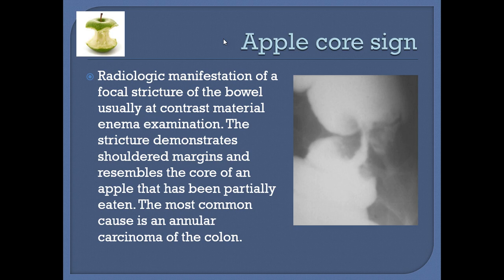Usually in obstruction we prefer to give gastrografin because barium is a thicker compound, and if there is some obstruction, the water is absorbed because the bowel transit time is increased and the residual barium is like a stone, so it will further aggravate the obstruction.